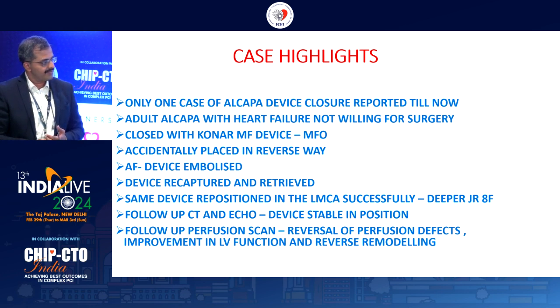What do you think is the ideal case for these types of interventional procedures? So ideally, Alcapa should always go to the surgeon. Only in desperate scenarios where they are just not willing for surgery or there's an absolute contraindication to surgery. They were seen in 3 surgical centers, and our own surgeon referred the case back to us saying that they are not willing, and so we had to do something. In such a scenario, as a desperate measure, you can do this.